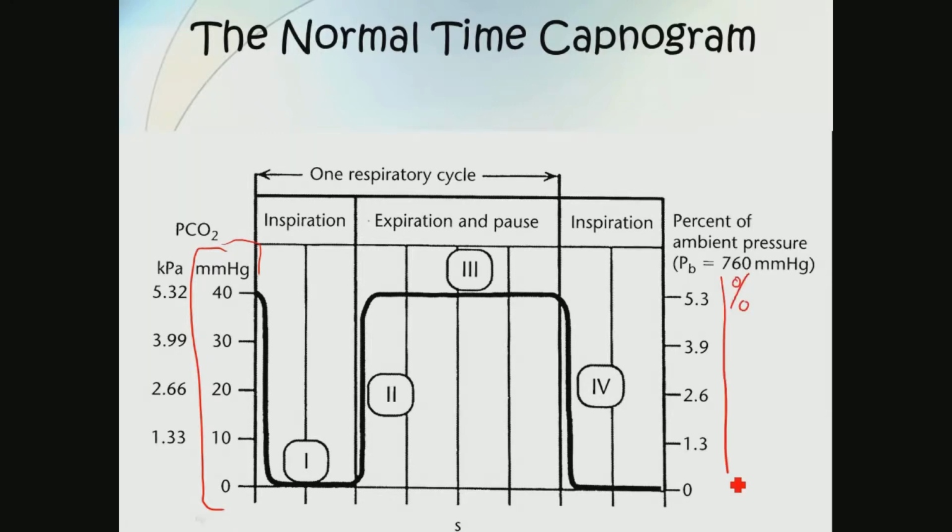The old EasyCap, if you look at it, the color changes. They had it marked off in percentages of CO2. And if you're really a nasty person, you flip it over so that it's now measuring in kilopascals, and everybody gets screwed up. That's what they do in Europe, not around here. But there's four basic phases that are present.